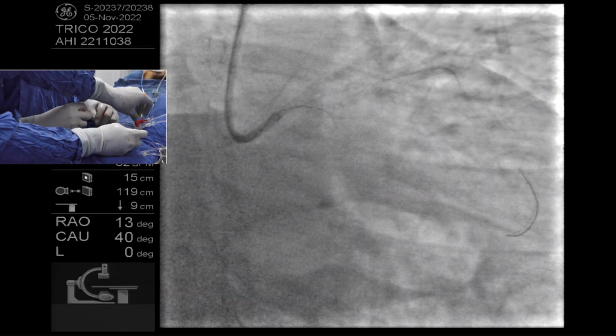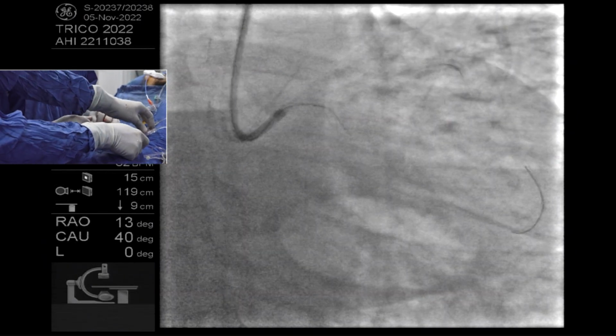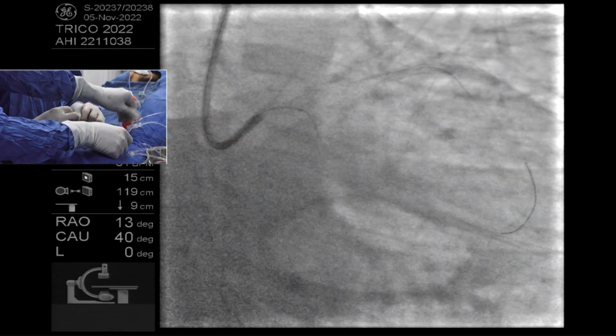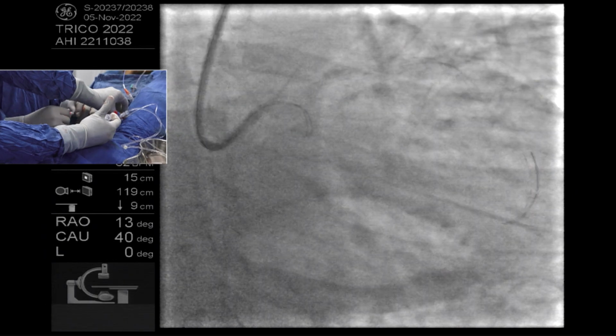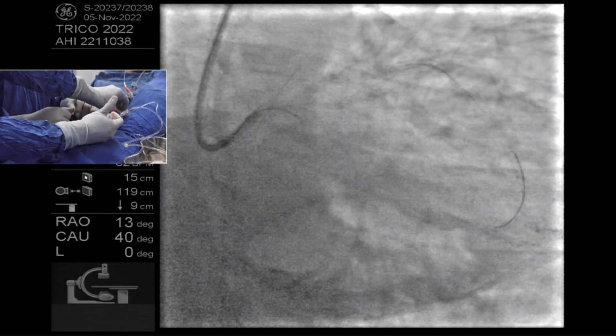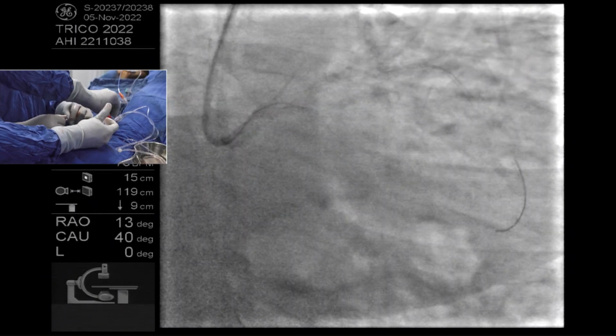But we did used to use the thrombus aspiration catheters for the diagonal sometimes. Sam, you and I used to talk about this many years ago. Yes, it could work. Again, it all depends on that proximal angle. I think that is making half of the difficulties here.